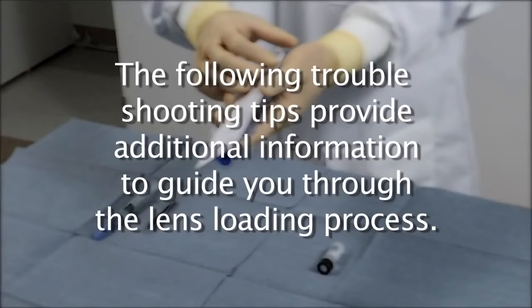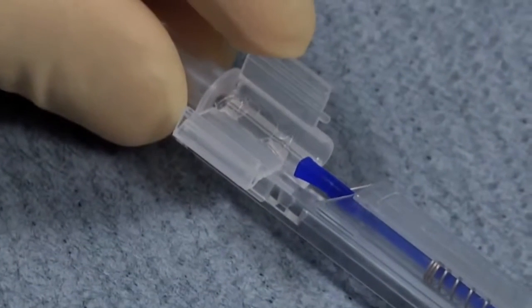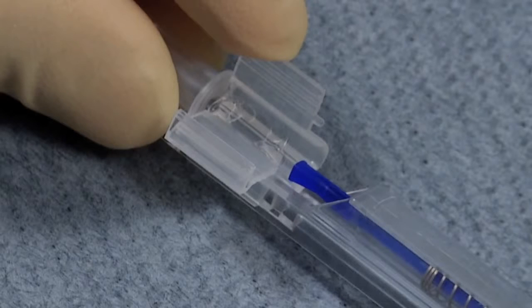The following troubleshooting tips provide additional information to guide you through the lens loading process. When closing the cartridge wings, note that if the cartridge is closed too far, the leading haptic may be pushed into the tunnel.